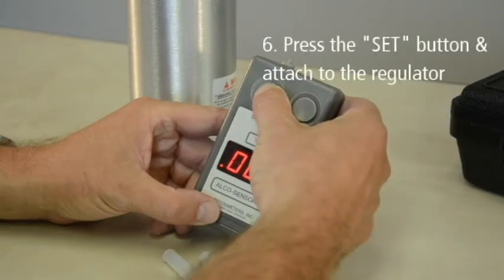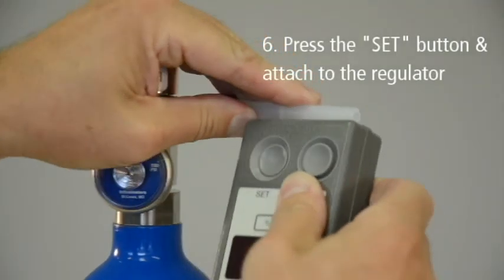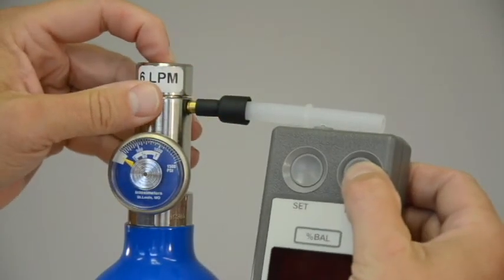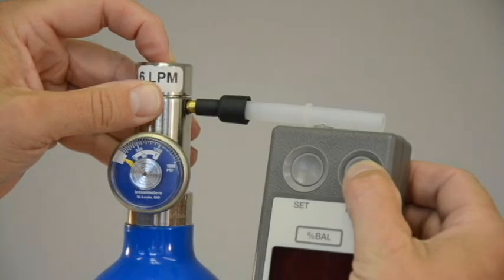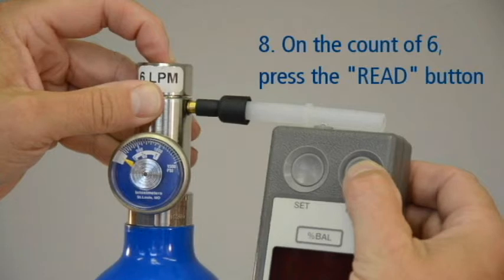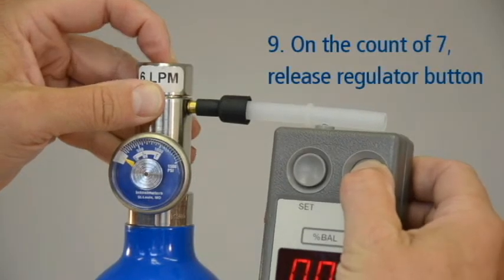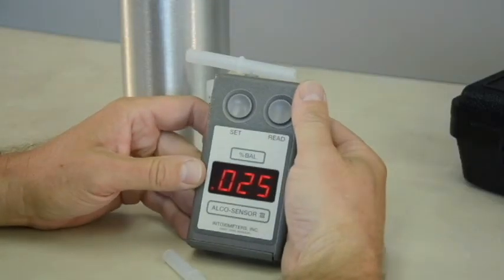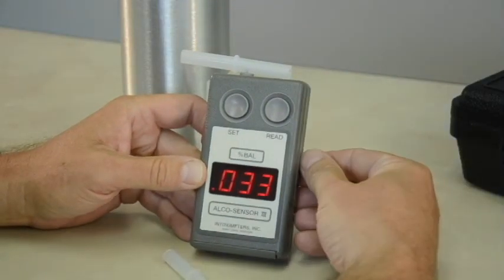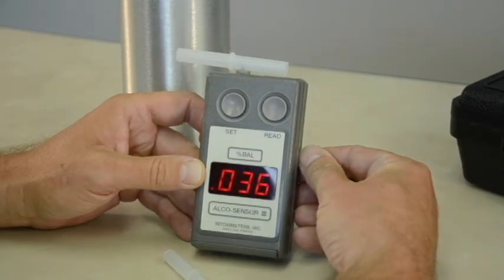Next, press the Set button and carefully attach the Alkosensor to the mouthpiece on the regulator. Press and hold the regulator button and count to 7. When you reach the count of 6, press the Read button. On the count of 7, release the regulator button. Gas must be flowing through the mouthpiece when the Read button is depressed. Remove the Alkosensor 3 and mouthpiece from the regulator.